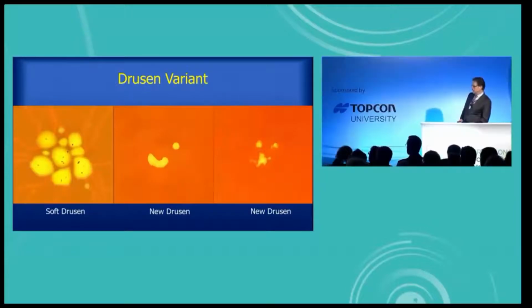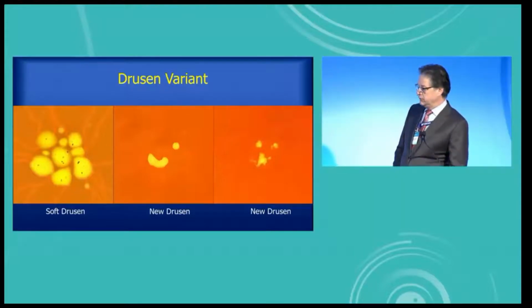I noticed a while ago that there is a special kind of drusen associated with thick choroids. And I'll show you some of the characteristics. I made this drawing to just show that. This is supposed to show regular drusen, and you notice they have a poorly defined outer border. They're kind of blob-like, and I didn't show them confluent here, but they're kind of pushed together. And I drew the idea that you could see the larger choroidal blood vessels underneath. And this eye also has focal hyperpigmentation.